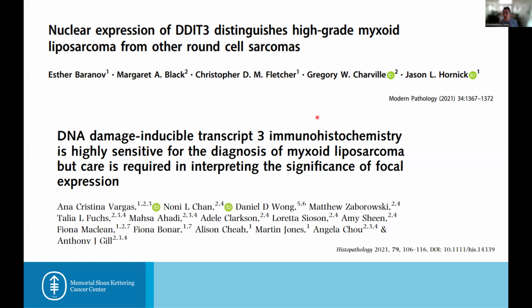And the other thing you have to remember, you may have the primary cutaneous, subcutaneous myxoid liposarcomas that are rare, but also myxoid liposarcoma is notorious for having a propensity to metastasize in other soft tissues. So you may have as a first presentation a case of myxoid liposarcoma, and then detect a primary tumor that was not known, let's say in the proximal thigh, which is a very common location. And sometimes if you have a funny or a very myxoid spindle cell lipoma, the differential can be a little bit difficult morphologically. So this is a stain that can help you a lot.